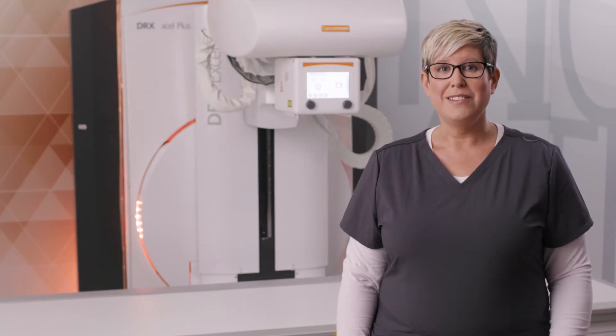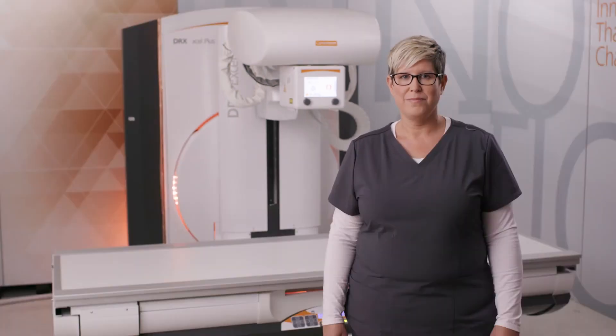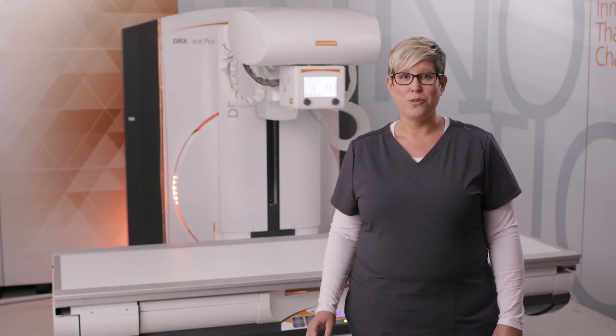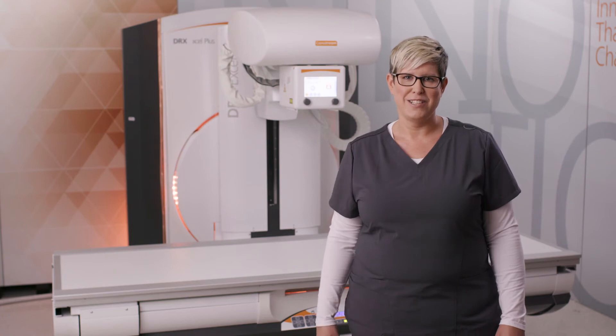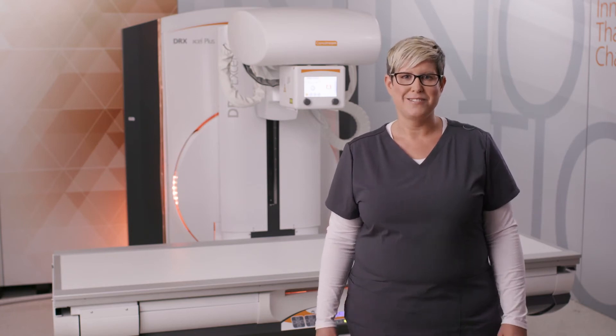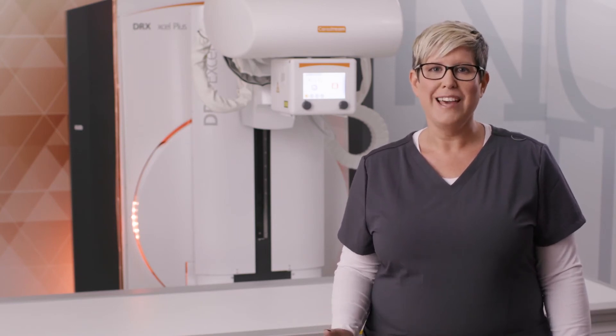Direct mode allows the tube to be unpaired from the detector so that the tube can be paired with a different device, such as a CR cassette or wireless DR detector. The tube is motorized and can be rotated from positive to negative 180 degrees for use with a wall stand. There is a variable SID of 110 to 180 centimeters, supporting both extremity work and chest imaging.